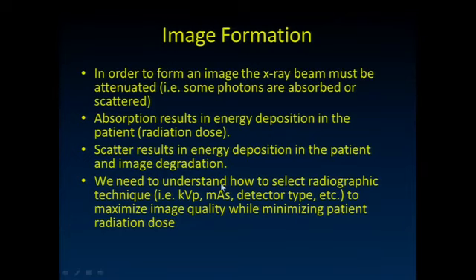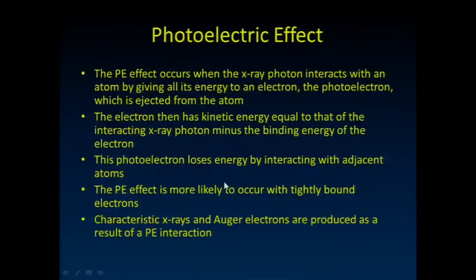We'd like to be able to understand how can we select our kV, our kilovolt or kilovolt peak on the X-ray tube, our mA, our type of detector, our type of filtration, our type of contrast, all these things to really make those interactions happen the way we would like them to happen to get the best possible image. That's our goal. So let's talk about the photoelectric effect.